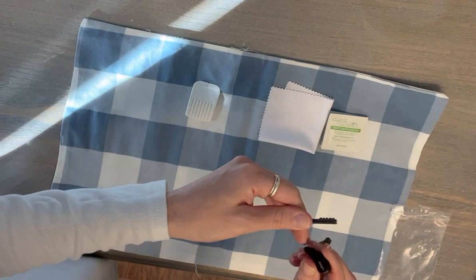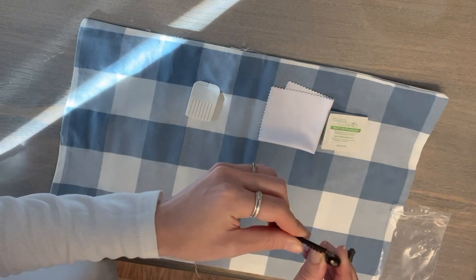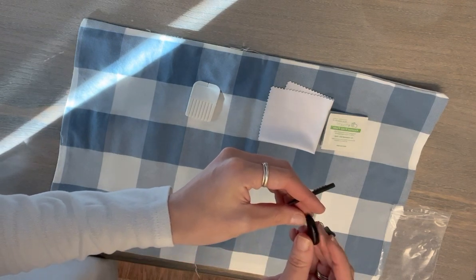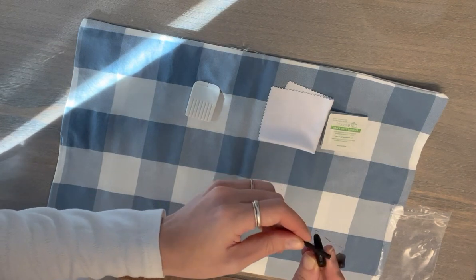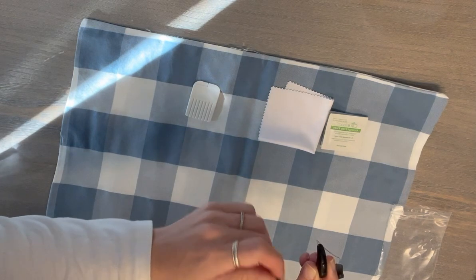Most hearing aids these days are rechargeable, so there is a little rechargeable port you can also brush away to make sure that there's no debris in there for the contact of the charger. There's little holes here you can make sure are clear, and then the volume button, the up and down, you can just make sure that there's no debris there either.